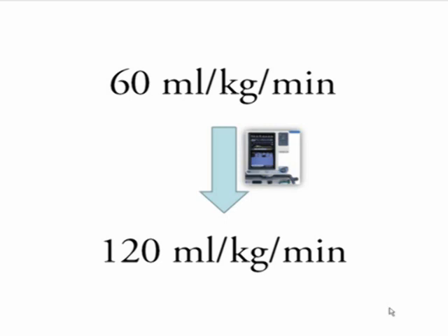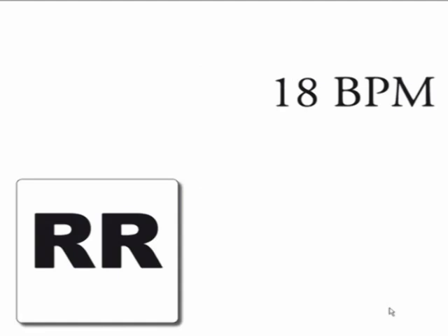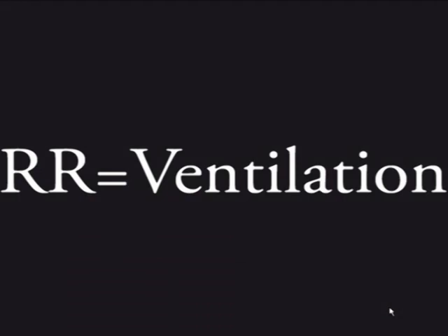So don't do it. You start your respiratory rate at 18, 16 to 18 if you really are scared of these high ones, but 18 is where I start. I'd rather they be a little hypocapnic than hyper. And I'll see my blood gas and I'll adjust from there. Do not start these patients at 10, 8 breaths a minute if you're using this lung protective strategy. They need the minimum 16 to 18 breaths per minute.